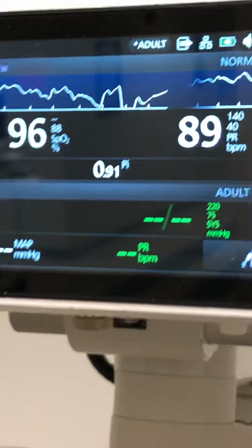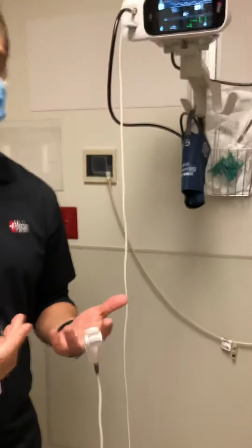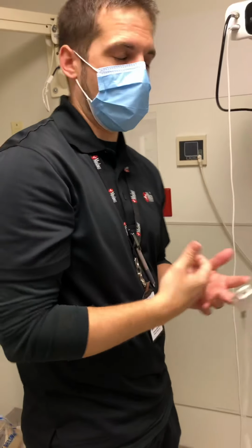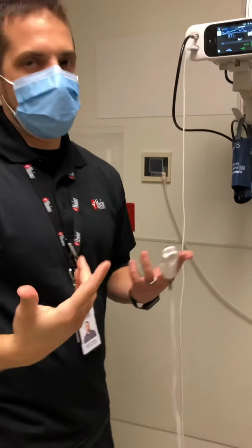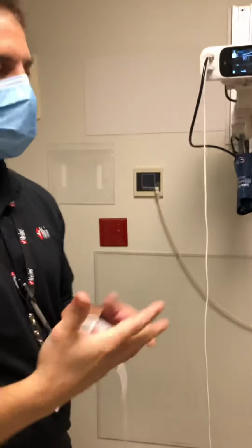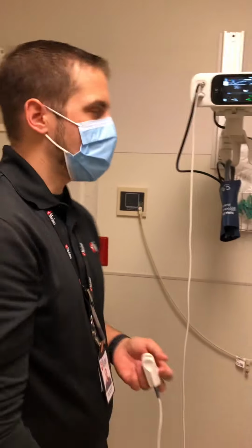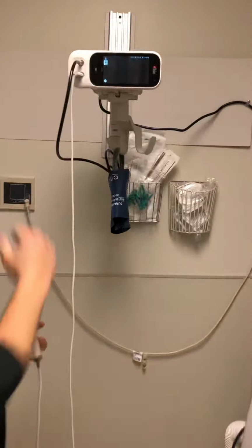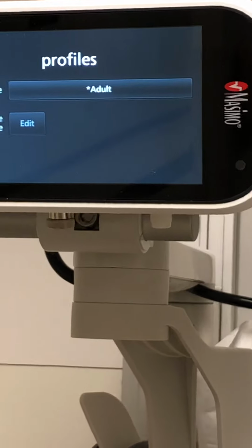I go back to the home setting, and you'll see that the light blue background has now changed. That's just more or less a visual indicator to each of you as you're working on your patients that someone made an adjustment away from the monitor default, okay? So if you were working on the patient and you came in and you saw the light blue background disappeared, it could have been another physician, it could have been another nurse, an RT perhaps, whoever. If you couldn't put your finger on exactly what was changed, please feel comfortable. You can touch on the profile itself. You can see how there's a little asterisk next to the adult profile indicating that someone made an adjustment.